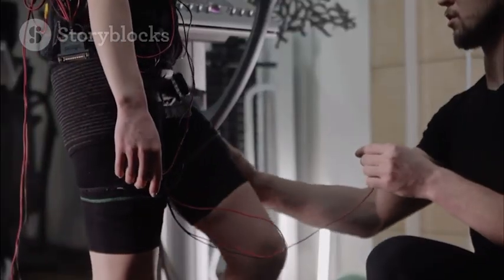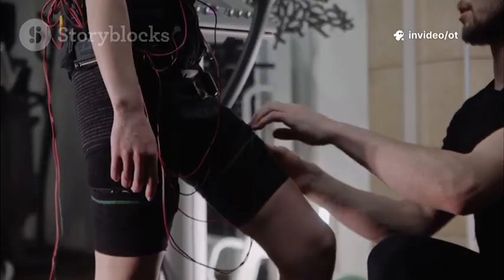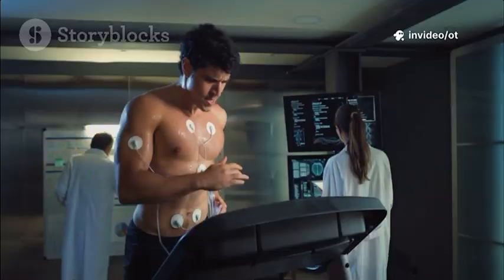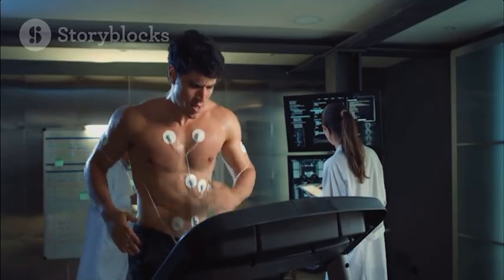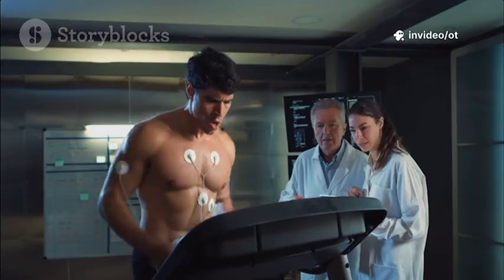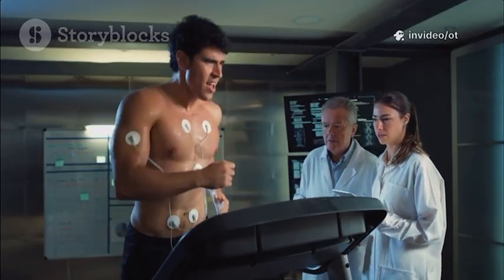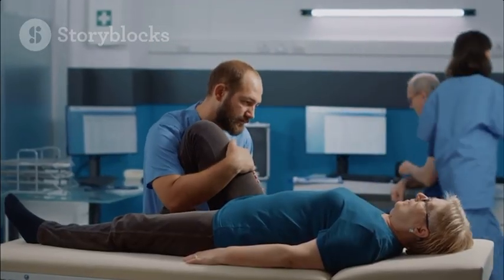For early post-op quadriceps inhibition, place one pad proximally, just laterally, and one distally medially, over VMO. Set 35–50 Hz, 300–400 µs. Cue the patient to contract with each 10-second on cycle for 10 to 15 reps several times per day, integrating quad sets, straight leg raises, and terminal knee extensions. Active participation is crucial for neuromuscular re-education.